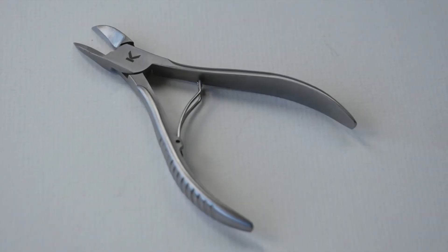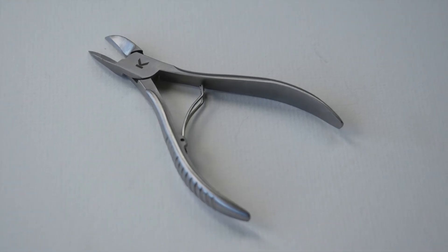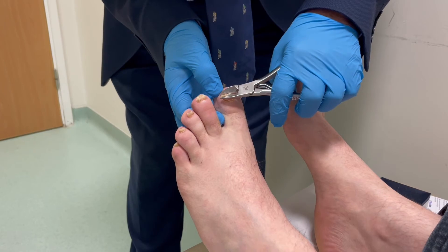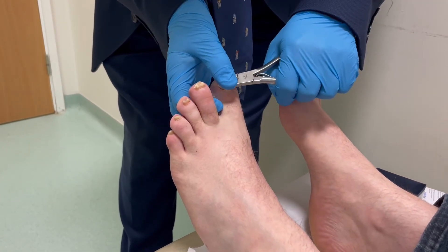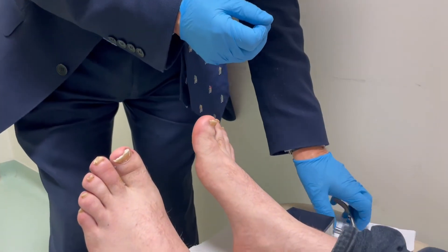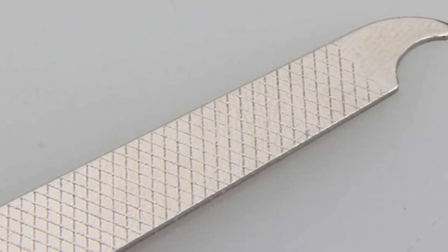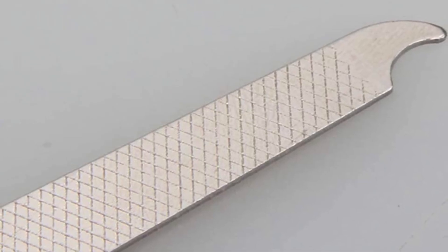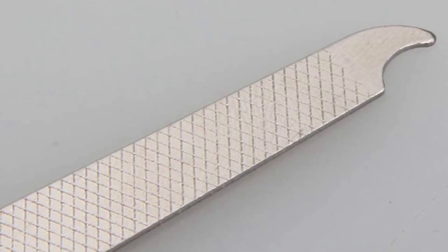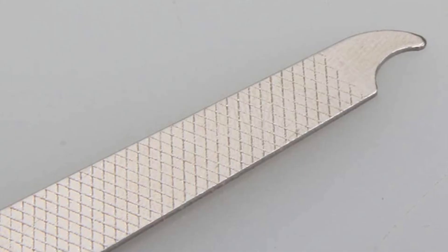Nail specimens can be obtained using nail clippers. The crumbly sub-ungual debris offers a good diagnostic yield, particularly if taken as proximally as possible. Gently scraping underneath the nail with the curved end of a nail file can most readily retrieve this material. The debris and nail plate can be sent off for both microscopy and culture.